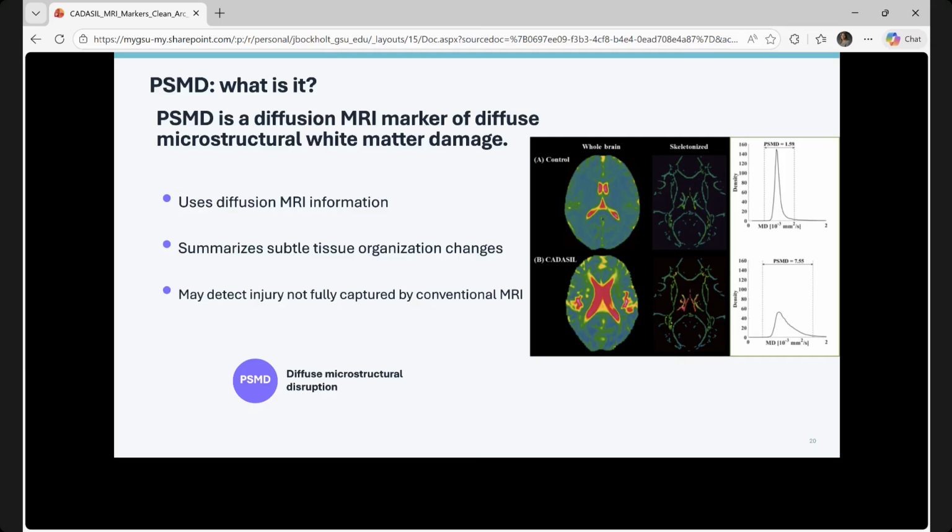And so that means that it's hard for water to move through it because fat and water don't like each other very much, right? And so when the structure of the white matter is changing and potentially has less fat, less organization, it allows more diffusion to occur. And so we can measure that.